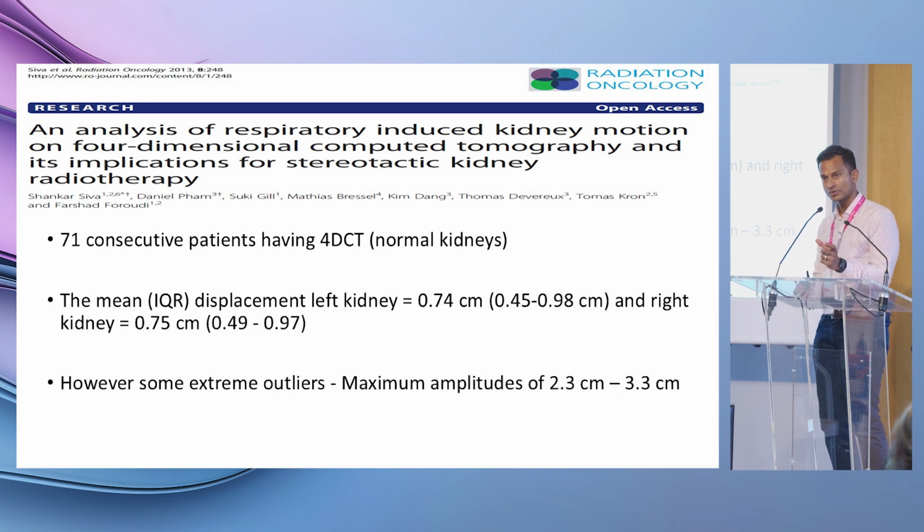The average tumor motion is 3/4 of a centimeter. Most patients, 75% of patients, have tumor motion less than a centimeter. So in fact, these patients probably don't need anything too fancy for treatment gating or for motion management.